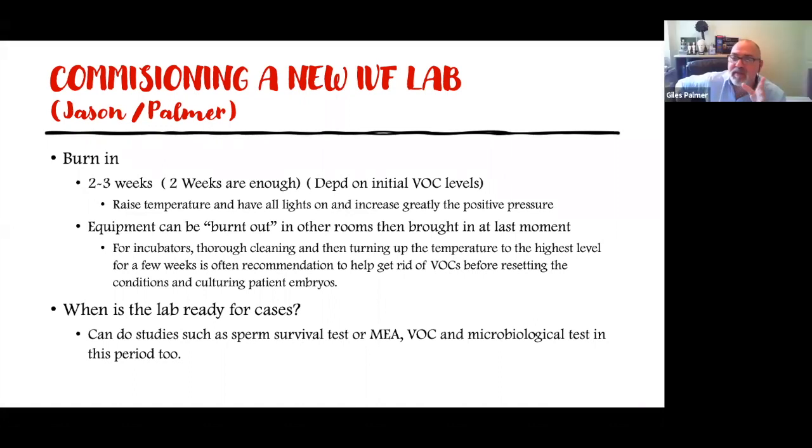Sure. Well, not just for modular, but any other lab which I look after, you have to get rid of those VOCs and that new smell, if you like, which you have in the lab. I did a study in 2010, which is still a very popular blog, on the VitroLife website, about cleaning air. I looked at every stage of a renovation period and which VOCs were released. And taking these precautions, we could get it down to 2 weeks after the finish of a project before we could start up our IVF unit.